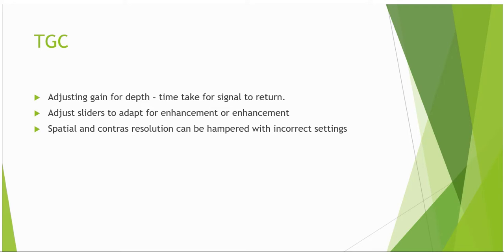To ensure we have obtained the optimal image, the sliders are used to avoid enhancement and shadow artifact, as mentioned with the previous pages discussing gain. Set inappropriately, we can lose spatial and contrast resolution.